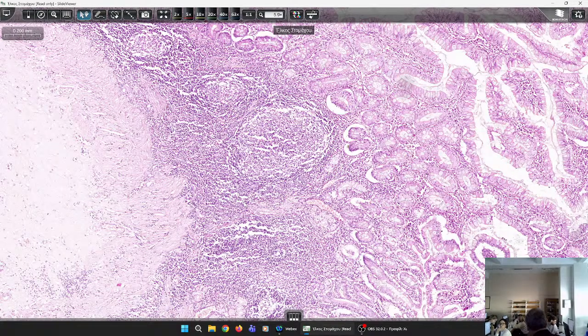Here we have an atrophic gastritis in the pylorus. So we see the lymphoid follicles, and it's most probably related to Helicobacter pylori infection, and of course we should give eradication so that the mucosa is cleaned, because all this lymphoid tissue may form a lymphoma, and furthermore it may predispose the mucosa of the duodenum to ulcerate.